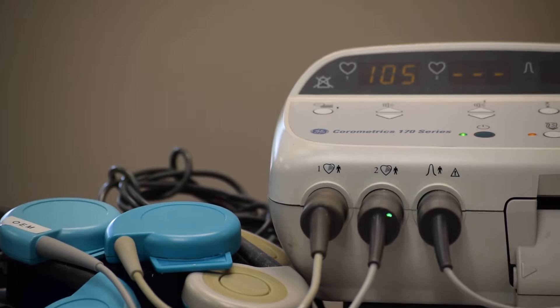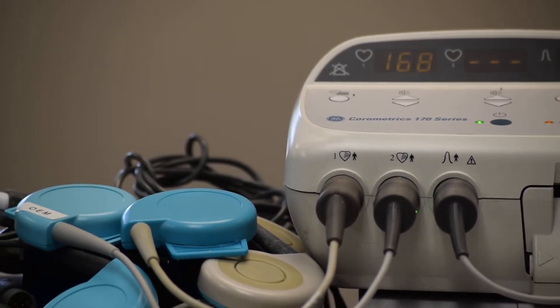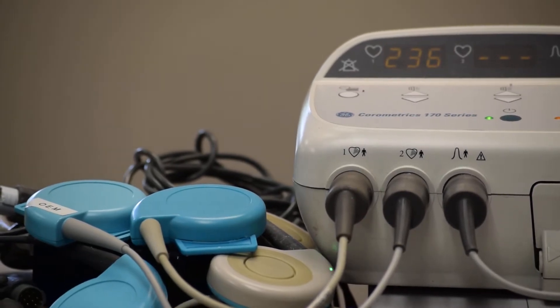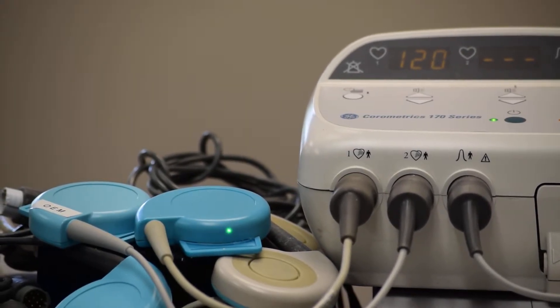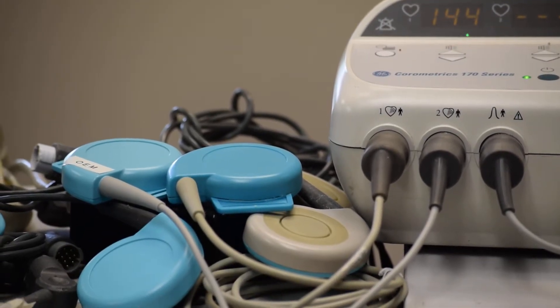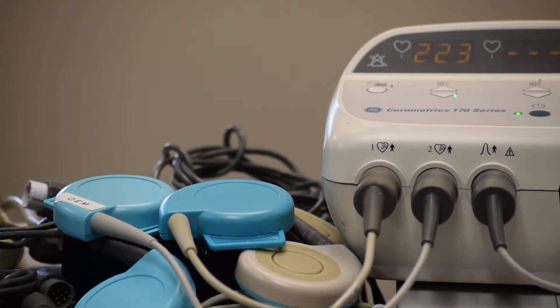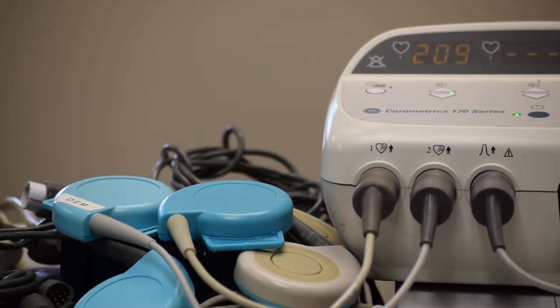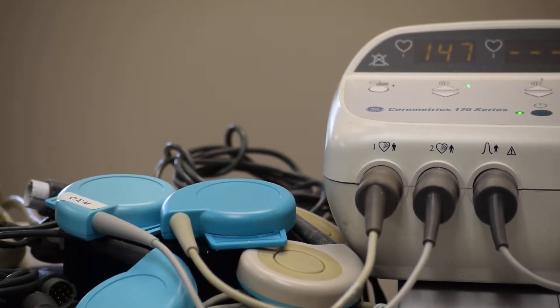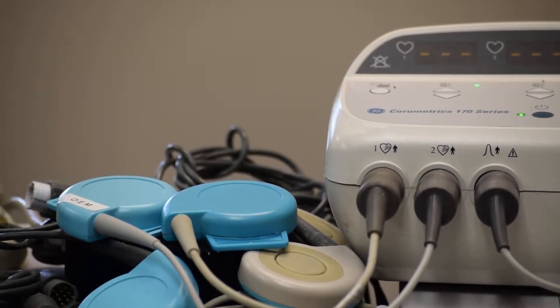Now channel one, which was OEM, has been transferred to channel two. Channel one now has the non-OEM transducer — 100% non-OEM. As you can see, the fetus heart rate display is spurious; it goes from 50–60 beats per minute to even 278, and keeps picking up intermittently.